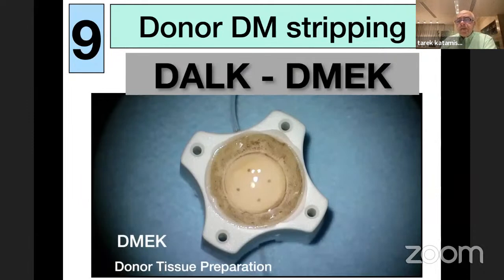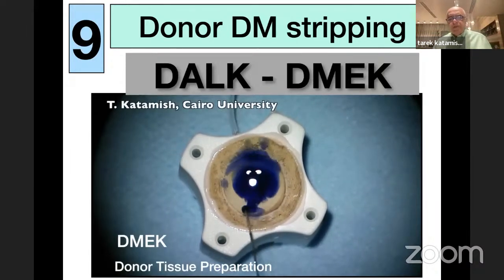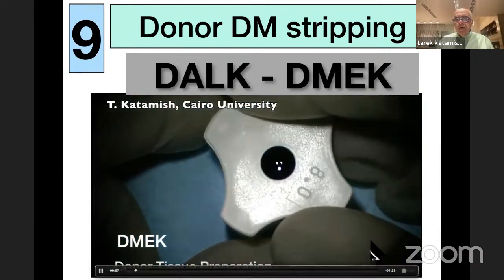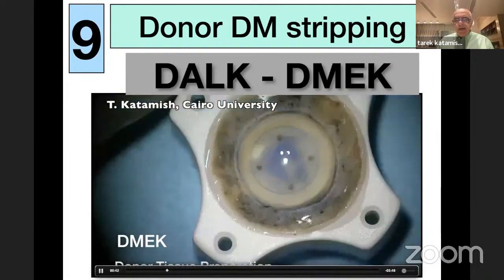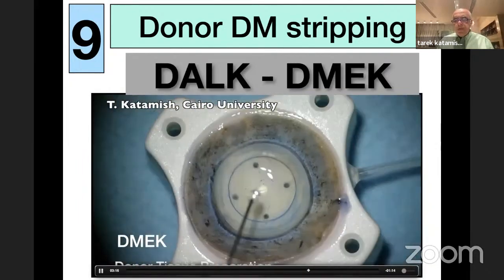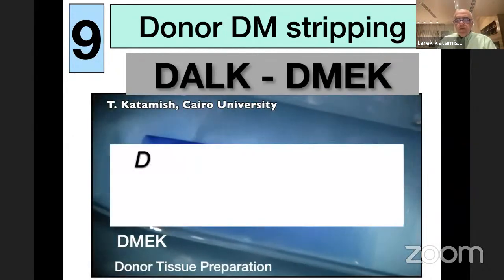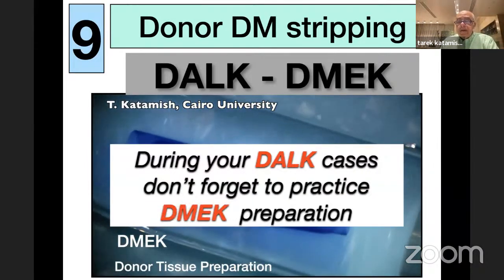A very important point at this step is don't waste this chance. This is your chance to learn half of DMEK. While you are stripping Descemet membrane, you can do it as if you are making a DMEK operation. So this is your chance to learn half of the DMEK operation during your DALK learning course. So as I always say, during your DALK cases, don't forget to practice the DMEK preparation.